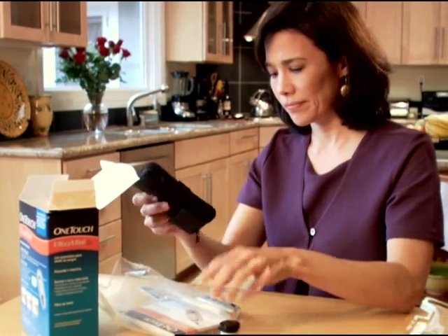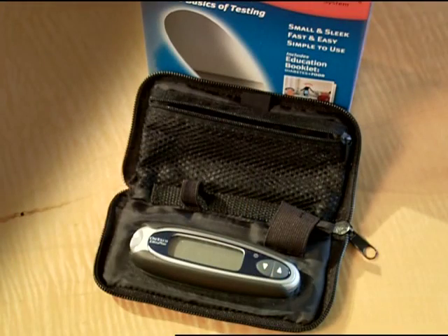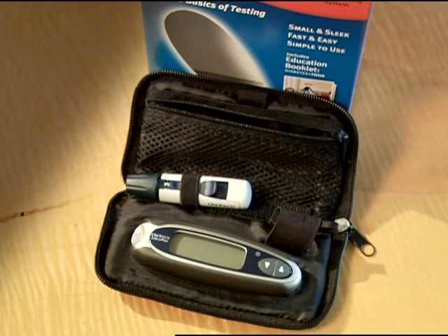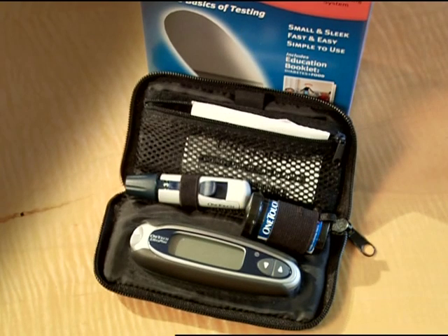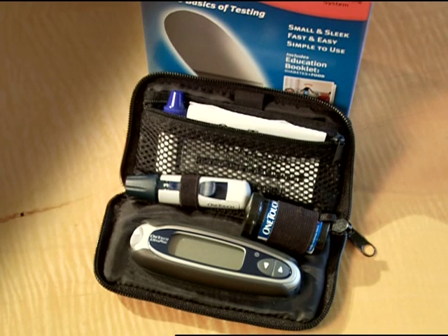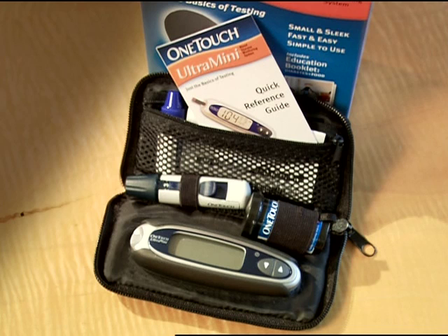The custom carrying case holds everything you need for testing: the OneTouch Ultra Mini meter, OneTouch lancing device, lancets, test strips, and OneTouch Ultra control solution. You can even fit the Quick Reference Guide inside. You should keep this reference tool with your meter at all times.